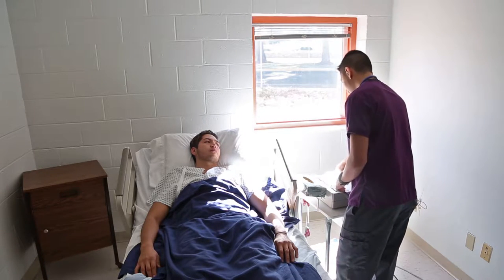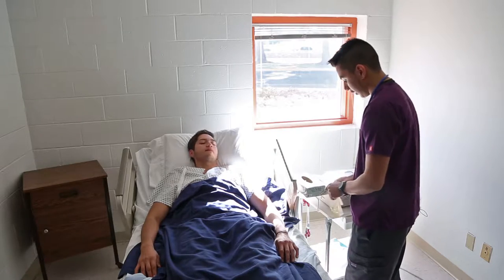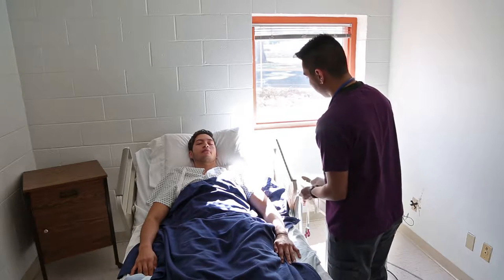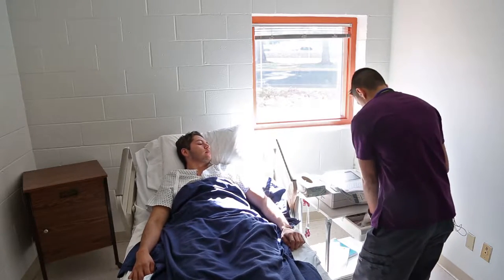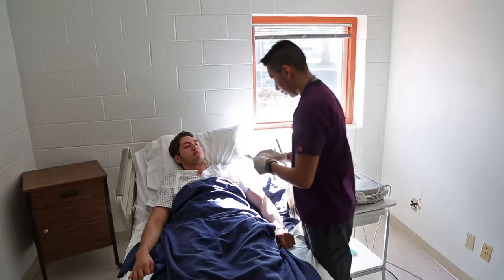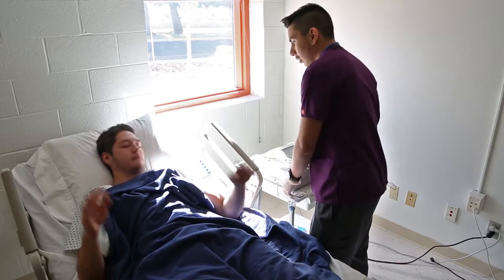We're going to go ahead and get this started. Before we begin, we're going to make sure we put on our gloves. Then we'll start putting these electrodes on. We're going to be uncovering your chest area, so I'll make sure I provide you some privacy. I'm going to be placing these stickies — two on your arms, some on your chest, and two on your legs. I'm going to be placing my leads right here to make sure they don't get lost. Do you have any electrical equipment on you, sir, like a cell phone?